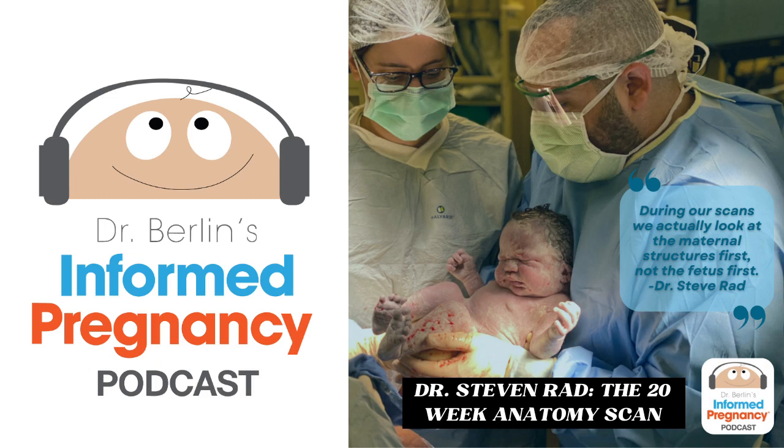And then 4D is live 3D. And so it's just a three-dimensional image live, watching it over time. The fourth dimension is a time dimension. And so you can see like the baby moving in the 3 dimensions and it's all cute. I personally haven't used 4D for any kind of diagnostic purposes.